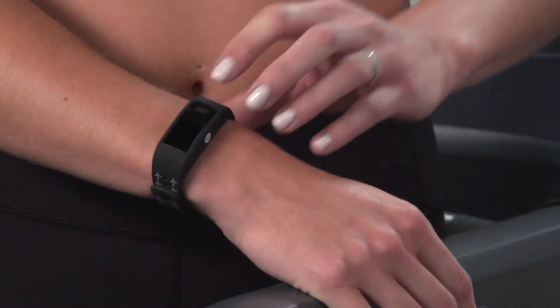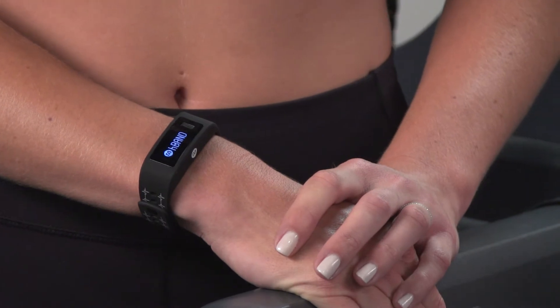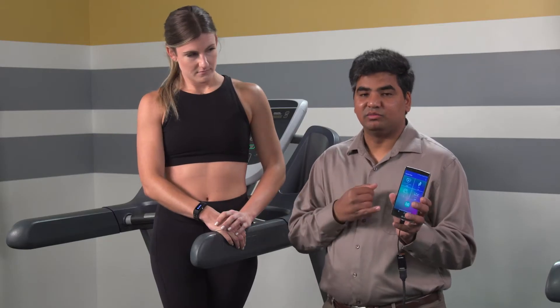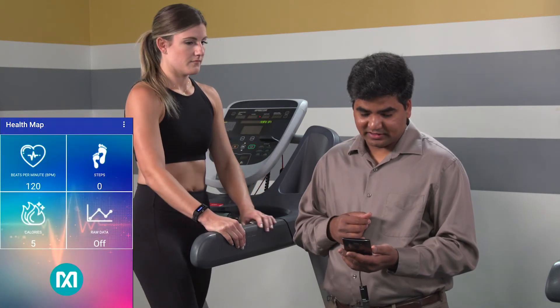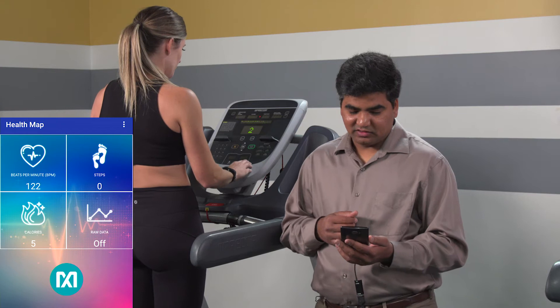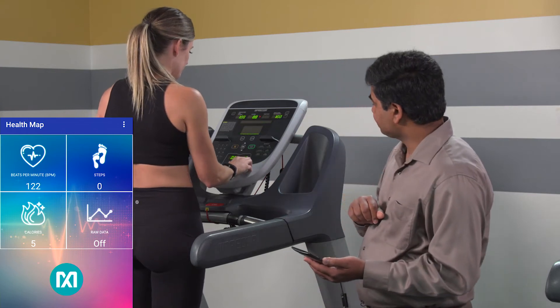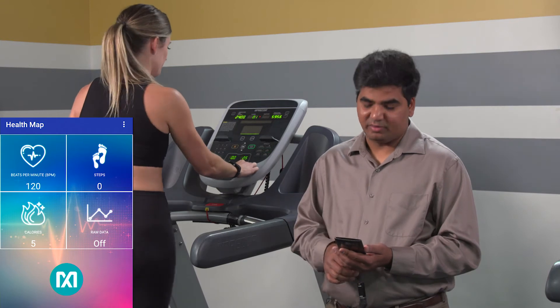If she presses the button, you can see her heart rate displayed on the watch, and you'll see the same thing on the mobile app, because the Healthband is connected to the mobile app through a Bluetooth connection. As you can see, her heart rate is at 120 beats per minute. While Alison is running on the treadmill, you can see her heart rate go up, and you'll see that also reflected on the mobile app.